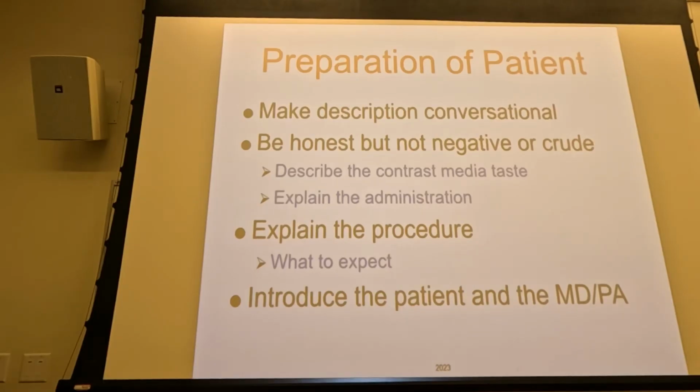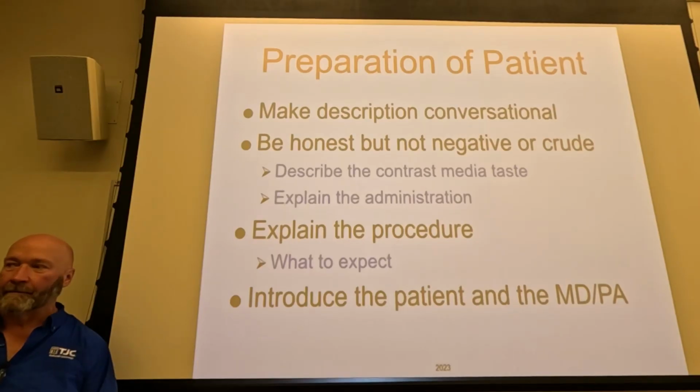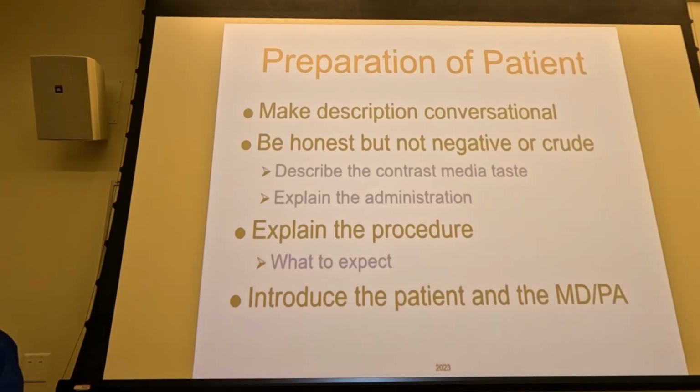We have exam types for the upper GI that we actually put through a tube in the nose. So most of the time it's just going to be drink, but sometimes there's that. Then tell them what to expect during the exam and after the exam. Barium comes out looking identical to what it went in looking like. At least a day, it's going to look like dried dog poo, the way it turns white. Don't use those words, but just tell them it's going to come out looking like it went in, and they'll know what you're talking about.